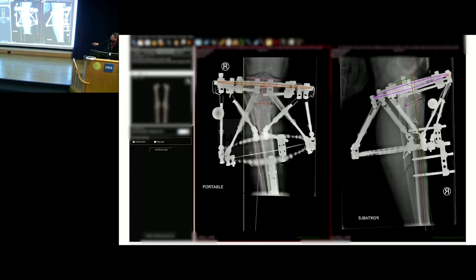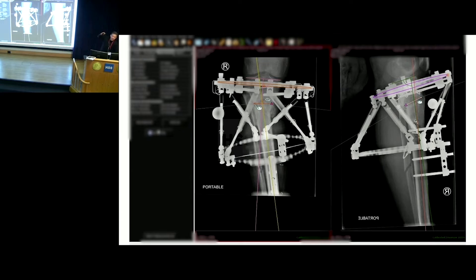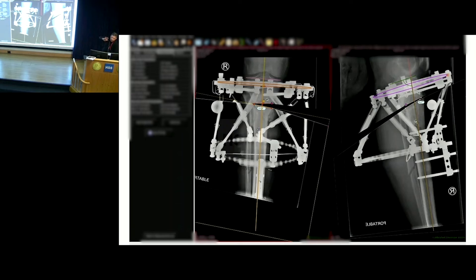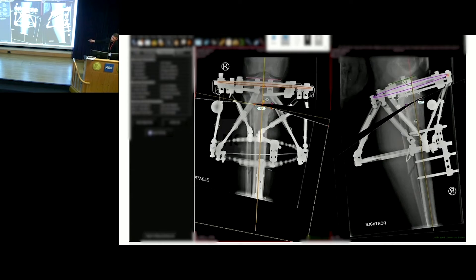There are some changes to 89 — you'll see the line shift a bit — then I'll do a simple line distally. You can change it to what makes sense, because in many post-traumatic cases you know where the non-union is, so you can make it fit. As you move this around and make it look like a bone, your deformity parameters change and your mounting parameters change. This is the entire workflow for planning a tibial hexapod using this virtual software. You need to know how to mount the frame, and then you just plug these numbers into the computer.